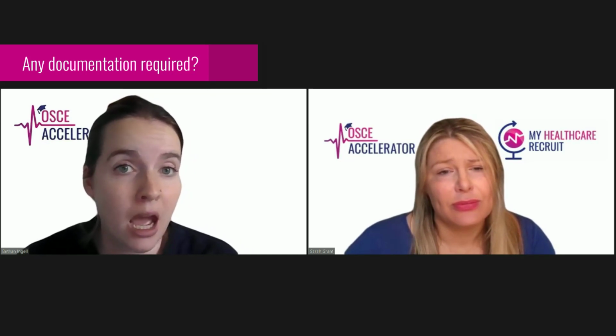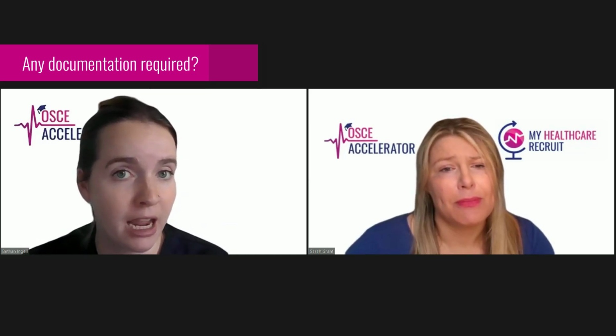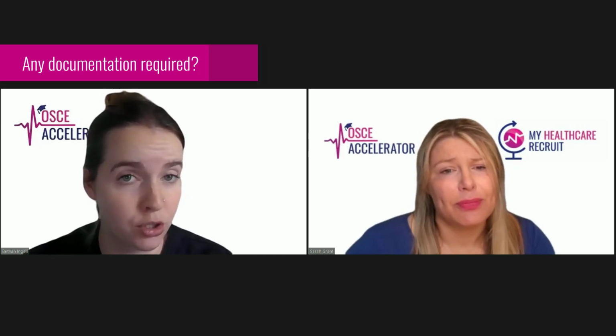In order to calculate what the patient's results should be, you need to have their sex, if they're male or female, their height and their age. So that all should be on your paperwork. If not, or if you find it difficult to find, just ask the patient, that's fine. According to that, you should be able to calculate what their average results should be.